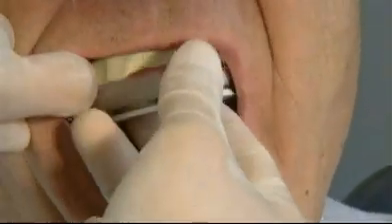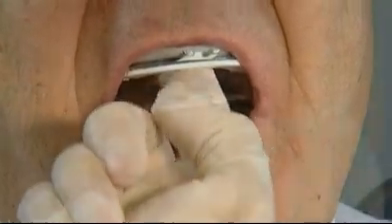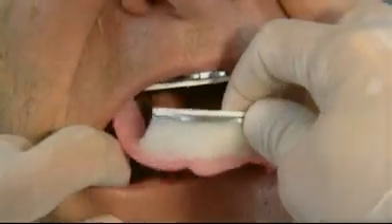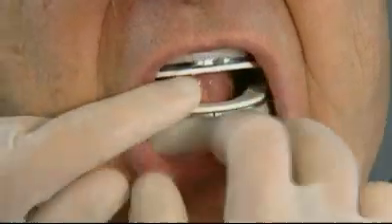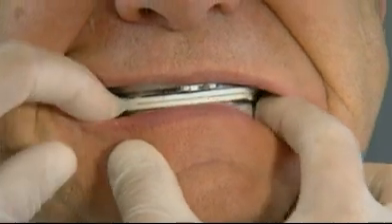Next, take the individual impression using a silicone impression material. During impression taking, the antagonist tray remains in the oral cavity. In this way, the correct relation for the subsequent registration is taken into account.